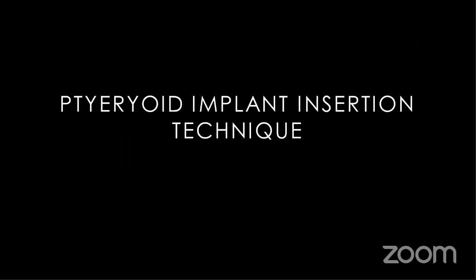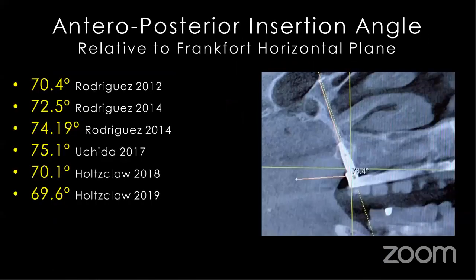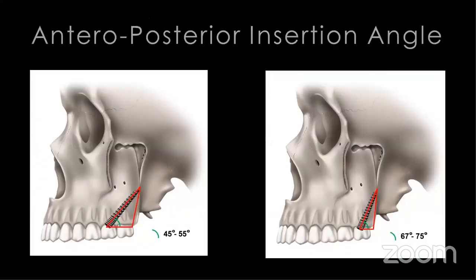So let's talk about the insertion technique. How do you do this? We have a case here, and if we analyze our angulation from the anterior-posterior direction relative to the Frankfurt horizontal plane. Once you read enough literature, you'll see that there are two camps. In one camp, the articles have about a 70 degree angulation anterior-posteriorly. A number of articles report this, anywhere from 69 degrees to 75 degrees. However, there are a number of other articles that are reporting angulations of about 45 degrees.